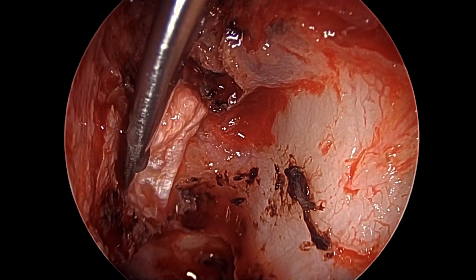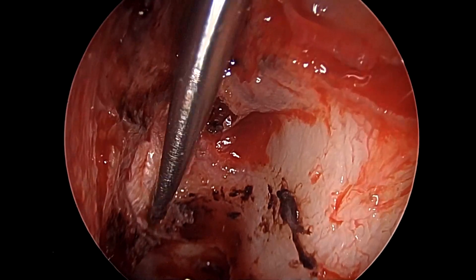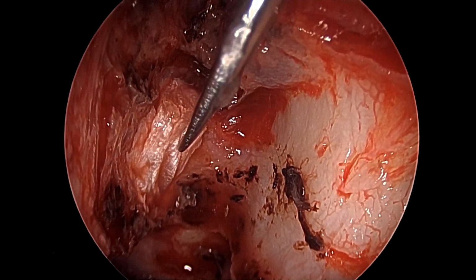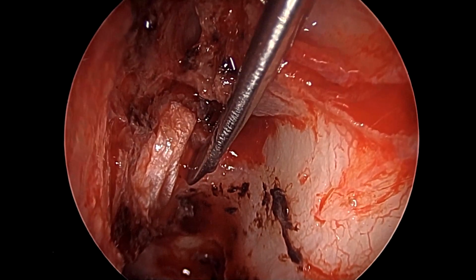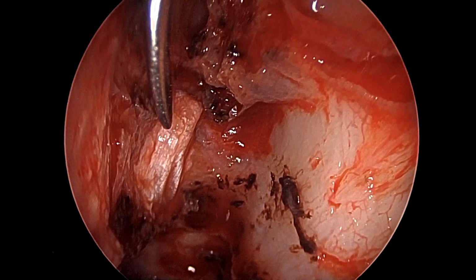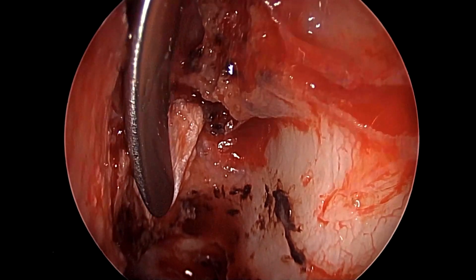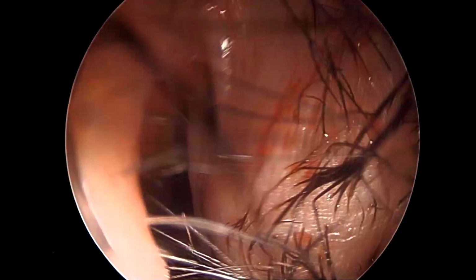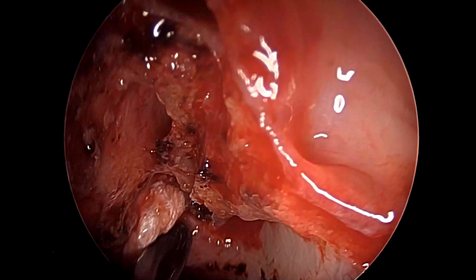This is one step which does require a fair bit of patience. One must not give up patience during this step. It could be many a time that the graft starts to come off from one portion of the reconstruction as we try to pull or push the other part, and one may need to make frequent adjustments to be very sure that the entire graft is located inside the bone and outside the dura, and not lying outside, because that could result in eventual failure.